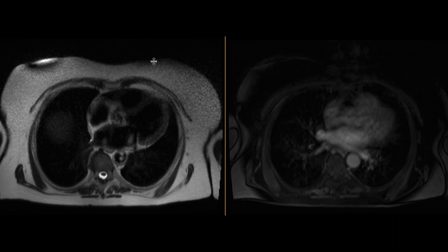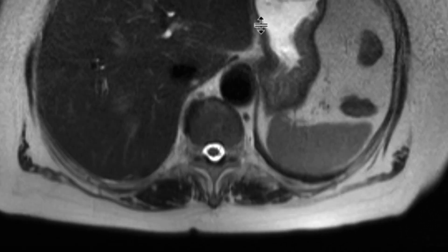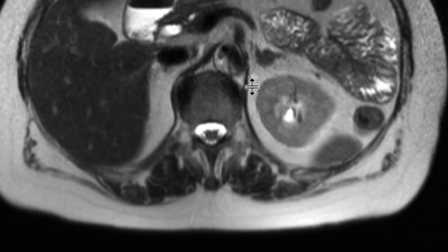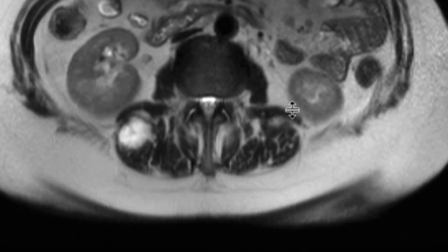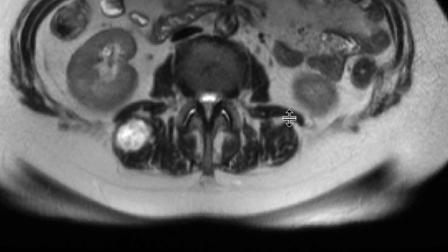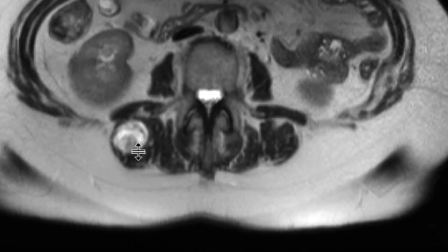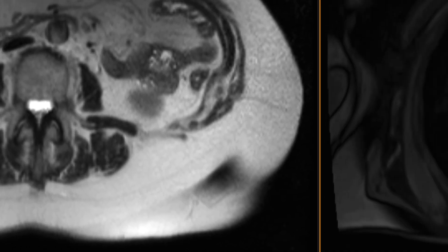This is a patient who had an outside renal ultrasound showing a mass in the soft tissues, and an MRI was obtained to further evaluate this. We can see on the T2-weighted images the mass in the paraspinal musculature on the right side. Right over here it looks rounded and internally has all these ring-like structures of T2 hypointensity, and it's pretty well defined as well.